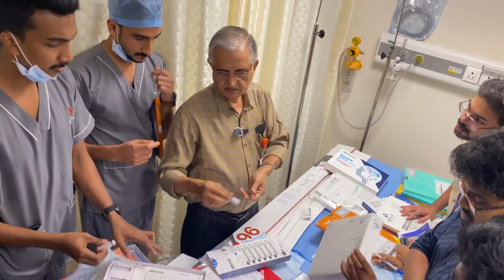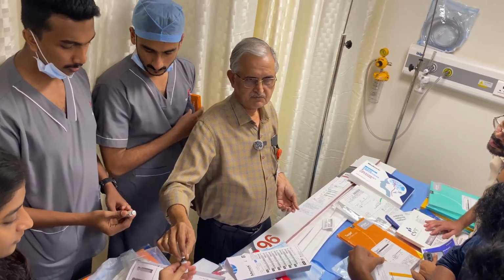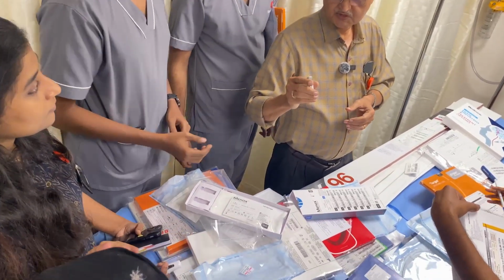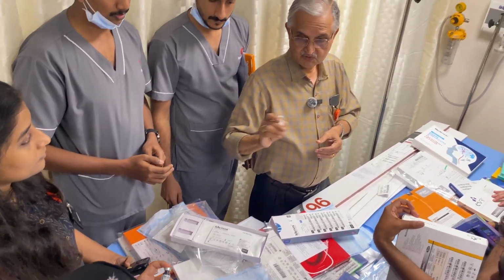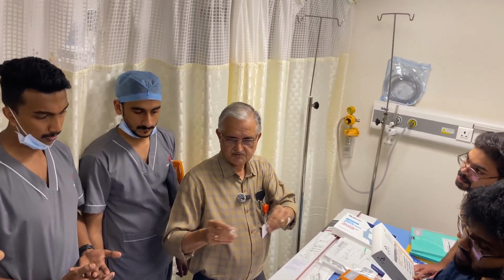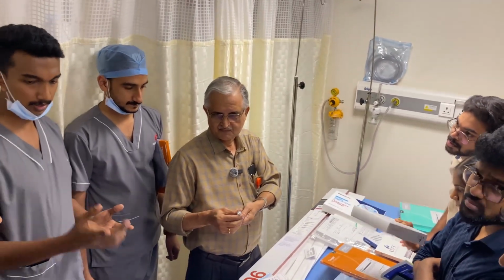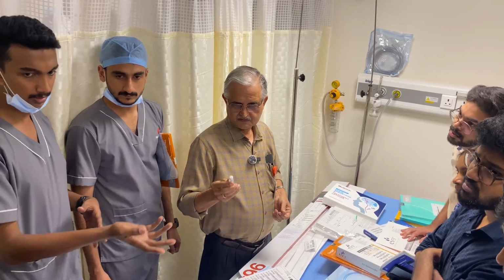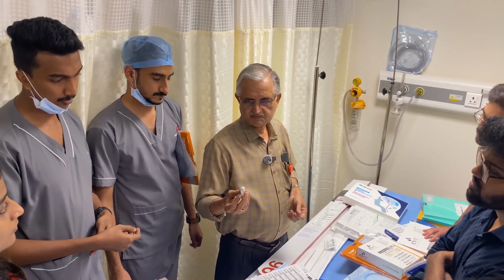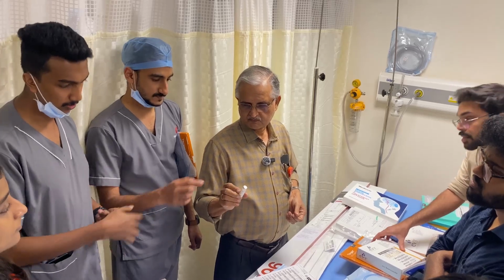It's like a tarry dark material, and you have to agitate it well. So there's a special type of agitator in which this is kept even before the procedure is starting. Then after agitating, it has to be pushed with something called DMSO.